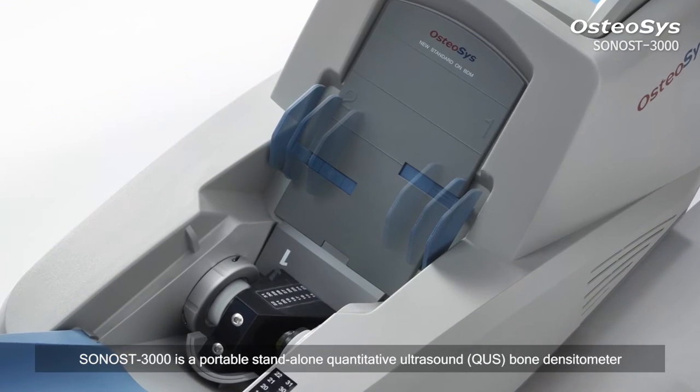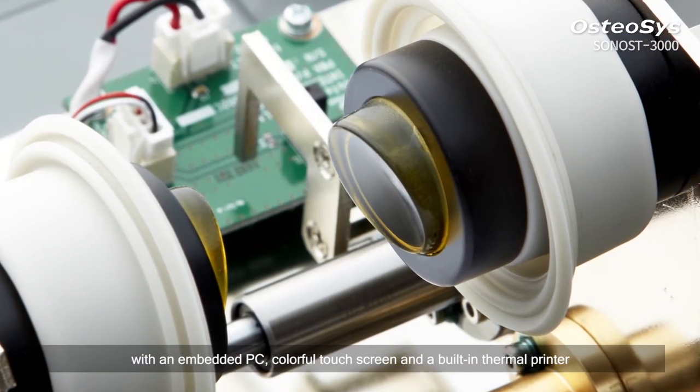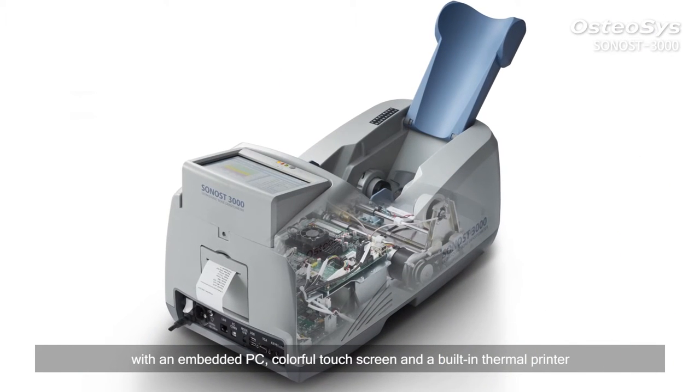Sonos 3000 is a portable, stand-alone, quantitative ultrasound bone densitometer with an embedded PC, colorful touchscreen, and a built-in thermal printer.